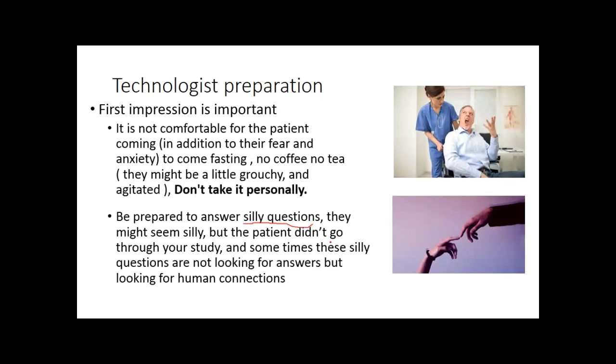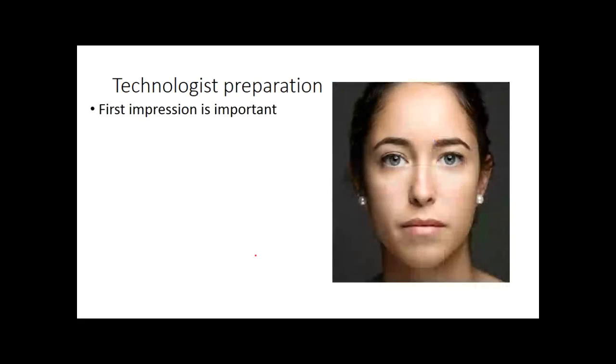Again, know that with these silly questions, sometimes they are not looking for answers, but rather for human connection. They might ask you, is it painful? Is it cold? Is it hot? How long will it take? You might feel that you answer these every day. Again, answer them, but answer them with a smile.